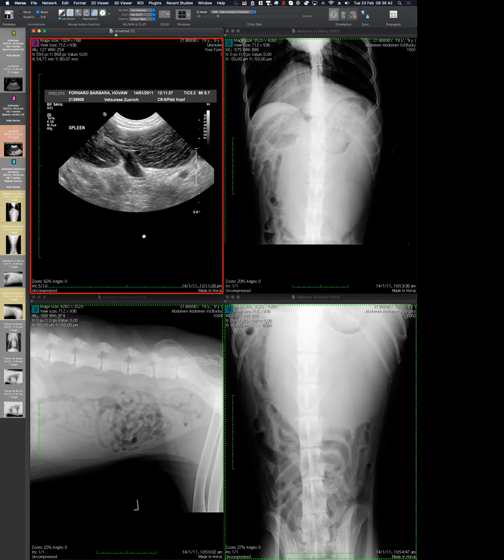Cool. And do infarcts look similar? Oh, by definition, I was just thinking about that. By definition, this is an infarct, if you want. A hemorrhagic infarct. Makes sense. You can divide infarcts into hemorrhagic, arterial or venous.